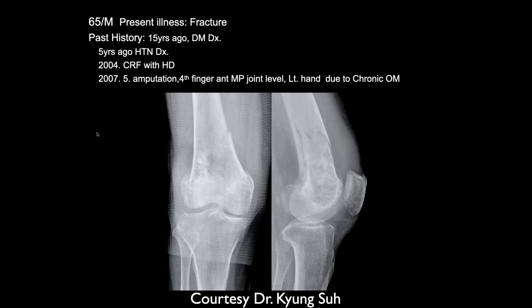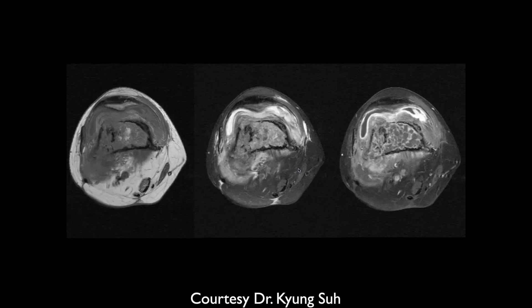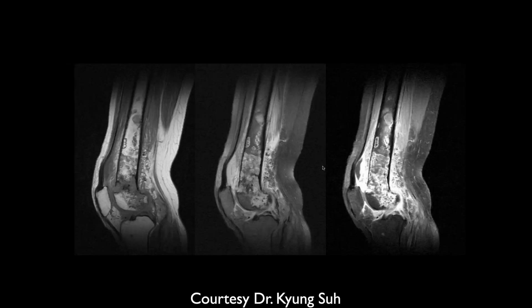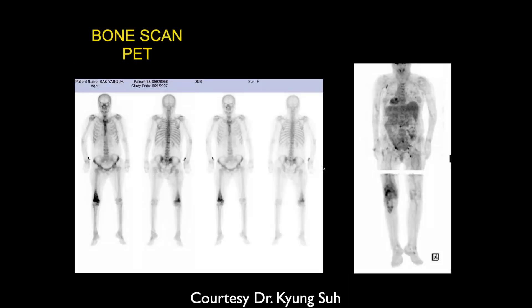65-year-old male with quite a bit of history: diabetes, hypertension, CRF, and amputation of the fourth finger MP left hand from chronic osteomyelitis. We're seeing the distal femur with a minimally displaced fracture through abnormal bone with mottled lucencies throughout the entire bone — it looks like a pathologic fracture. On MRI, there's marked heterogeneous signal of the bone, surrounding soft tissues, synovial enhancement, and marked soft tissue swelling. Assume this is osteomyelitis with pathologic fracture. A bone scan was obtained to make sure there weren't other foci because they were still concerned about malignant disease.